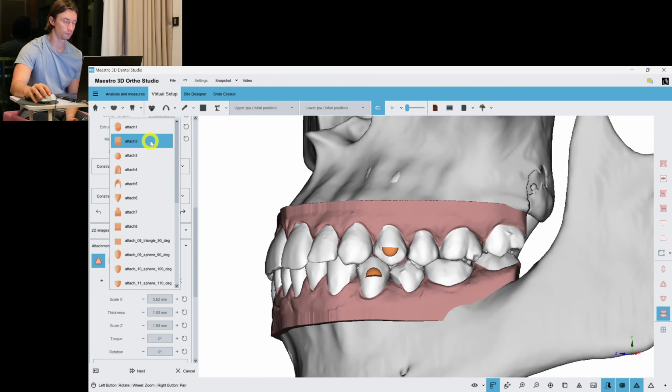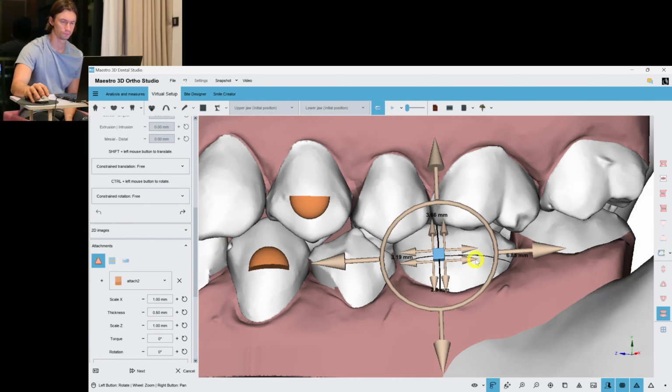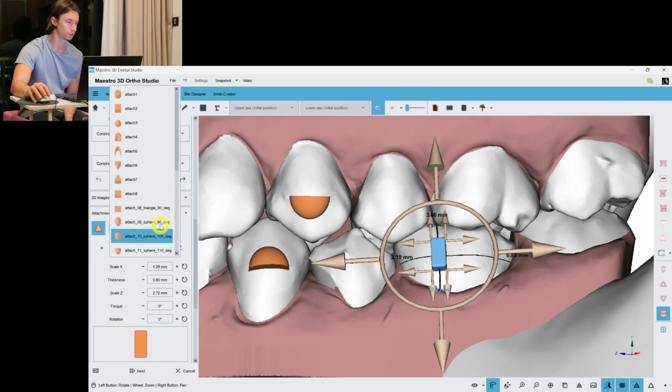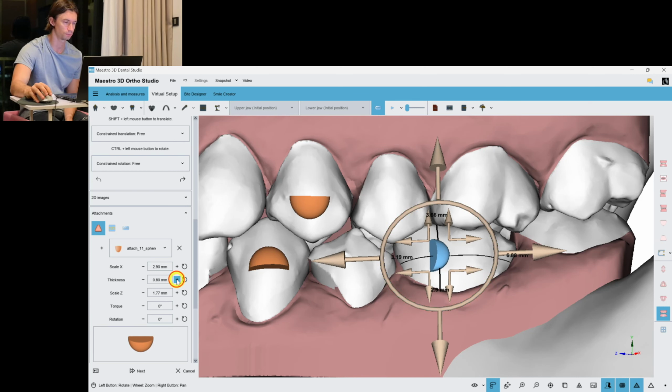Do we need some other attachments? I'm not sure, but let's put some double purpose attachment here, so it will work in two ways. It's going to be a retentive attachment as well as the attachment which is going to help us with this distalization. No, I'll change it to this shape, which I like more. It's not good for retention, but I hope that the anatomy of the crowns will help the retention.